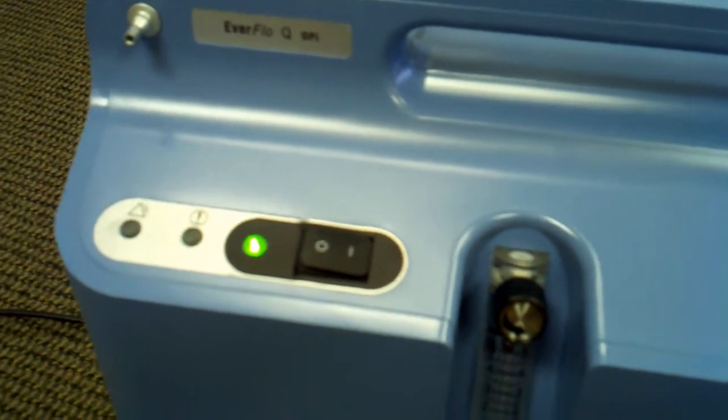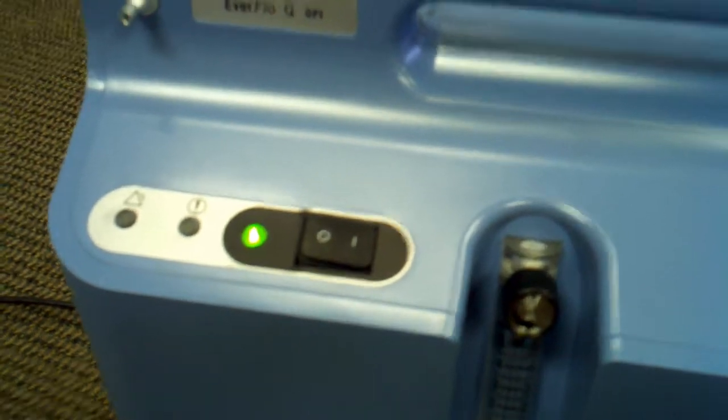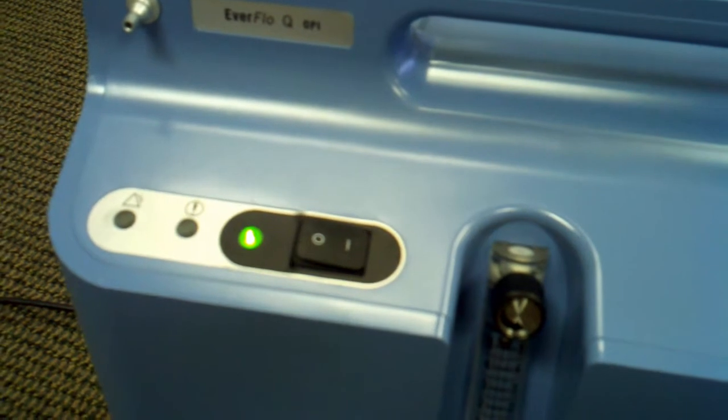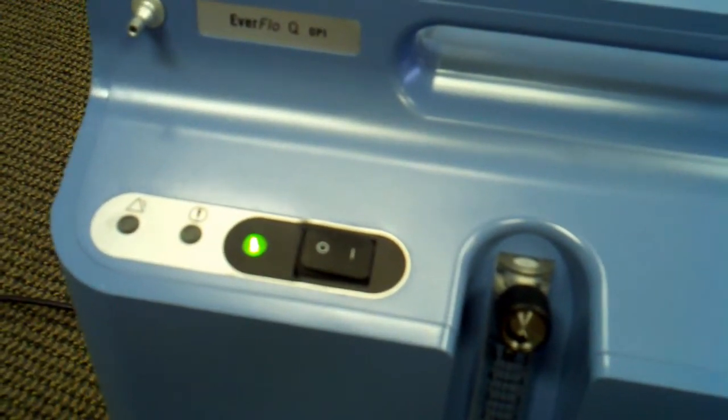The OPI is not a necessity, but keep that in mind — these are very reliable machines, but obviously keep that in the back of your head when ordering if you want the Oxygen Purification Indicator.